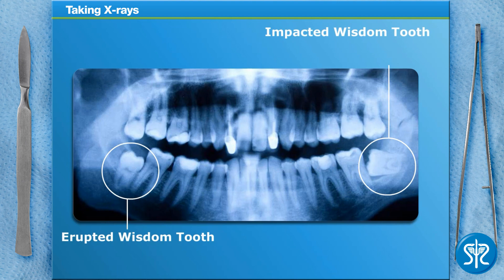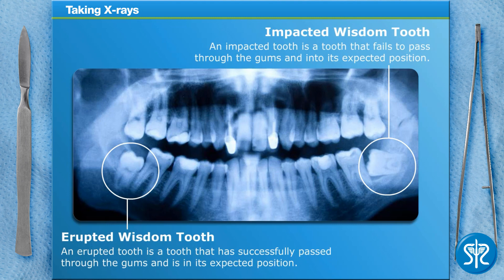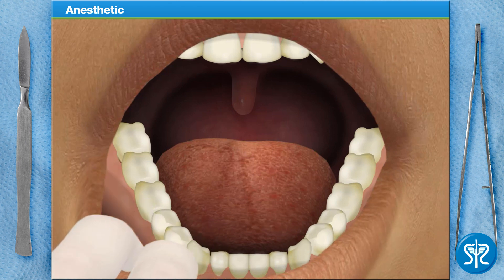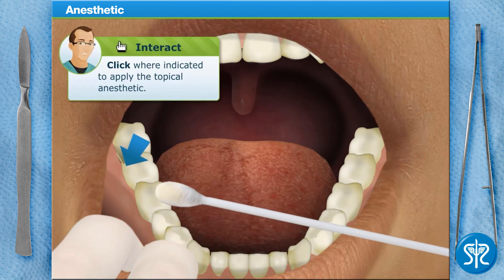Patients that have two or more wisdom teeth extracted or have impacted wisdom teeth may choose to receive a general anesthetic. When a patient has an impacted tooth removed, the procedure is referred to as a surgical extraction. Our patient today is only having one erupted wisdom tooth removed, and has elected to go with a local anesthetic. To begin, you'll need to apply a topical numbing gel to the anesthetic injection site.